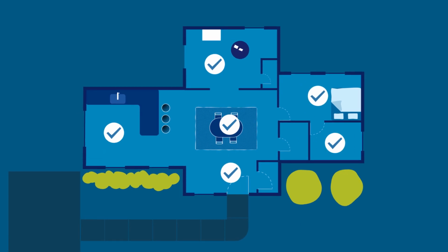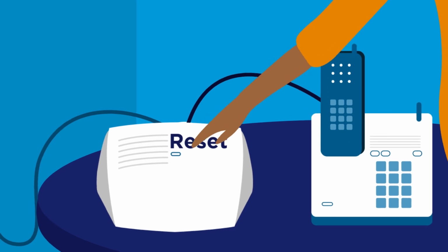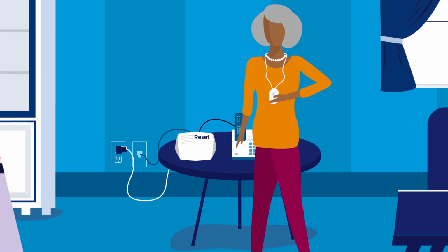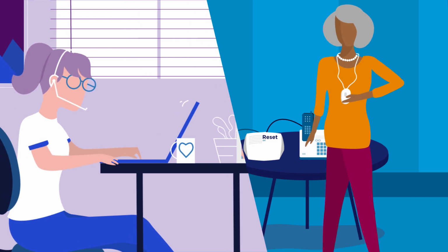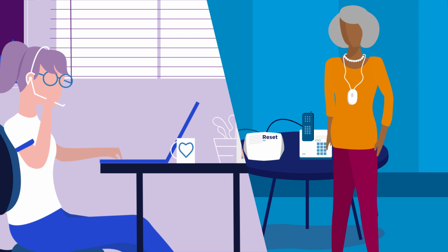When you've tested your help button in each room, press the reset bar on the home communicator again. Then press the help button you're wearing. This will connect you to a Philips Lifeline trained care specialist. They'll confirm your setup and answer any questions you may have.